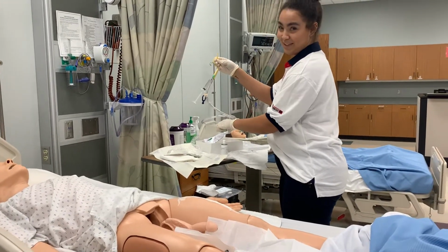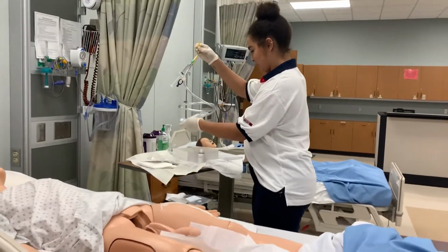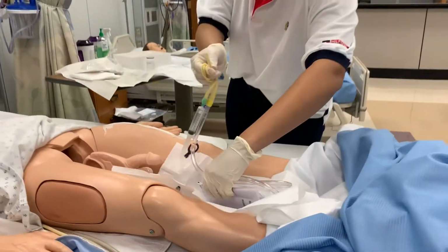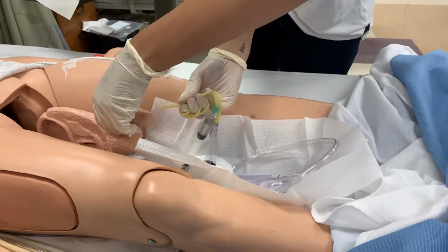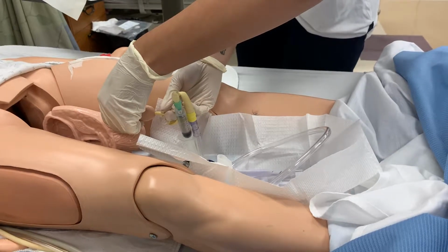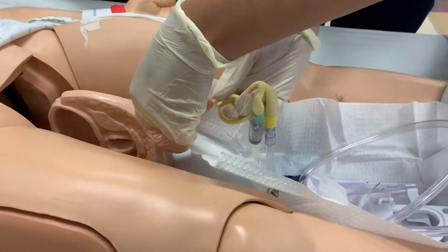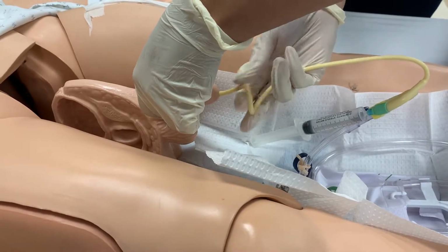Okay, I'm going to bring this over to my clean field, and I'm going to grab with my left hand and insert. Okay, here we go.